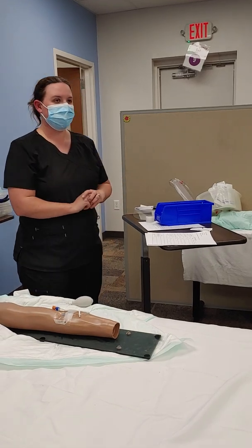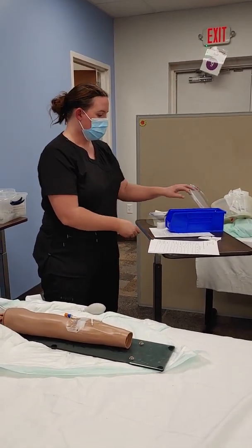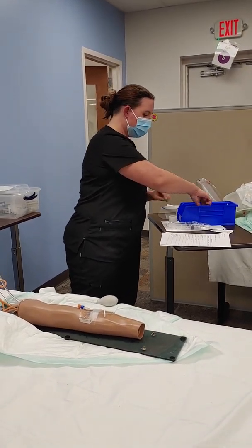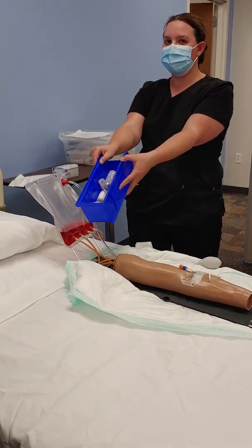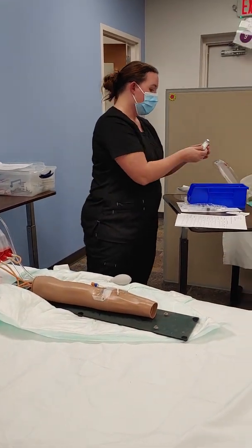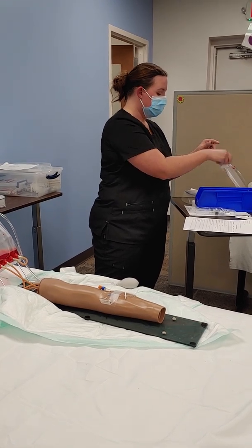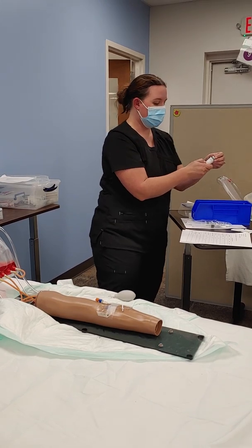Read MAR and select proper med for medication supply system. Pick Omnicell or patient med drawer. First med check. So you will notice there is a bunch of meds in here. They are not all Martha's, they are not all furosemide. You will have to look through here and select the right medication and the right patient. That is Kelly. There's Martha, she's got furosemide.